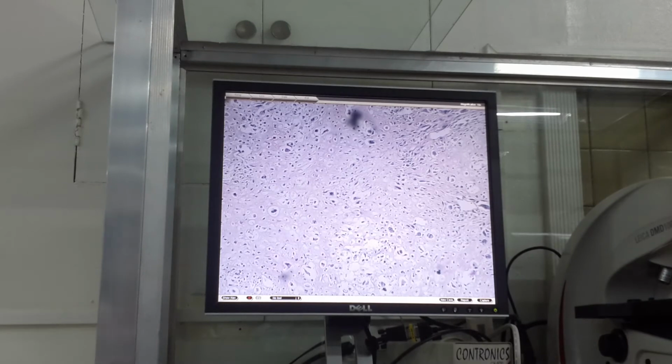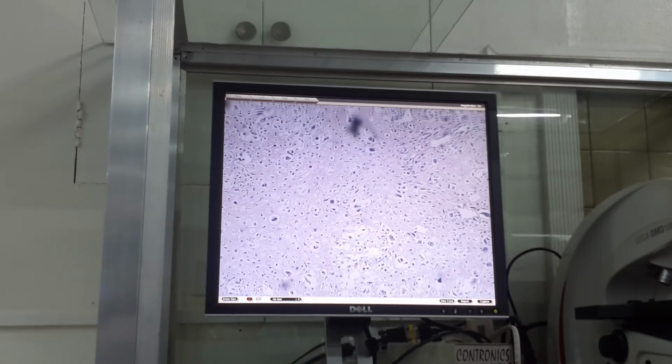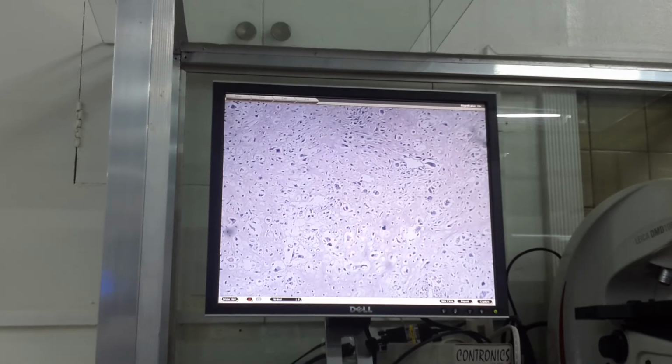Okay. Does it show you malignancies? Signs of malignancy, cytologic signs of malignancy. Pleomorphism, hyperchromaticity, increased nucleocytoplasmic ratio. Tama? What matrix is it producing? Eto? Ay, nasa ba yung pointer ko?